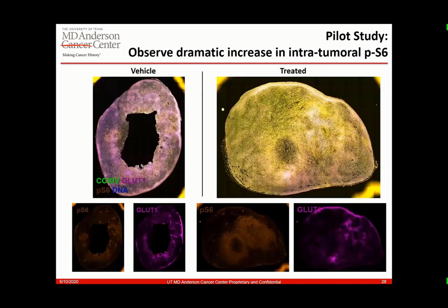So kind of just as a proof of concept, I wanted to show you an observation we saw with treated and untreated samples. Now this is one particular case where we didn't know anything about this tumor. It was a total pilot study, and I just thought it would be a nice way to turn essentially a study with 20 mice into one tissue microarray and see if we could recapitulate some of the things that we've seen in the staining.